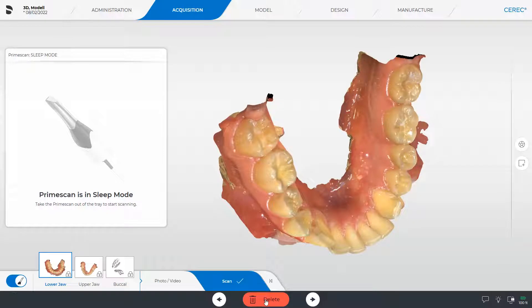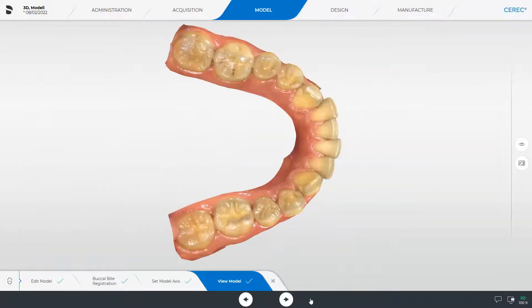We now go to the next phase, the model phase. This phase can be used for patient communication. In this case, we have already removed some areas which are not needed for a solid model in the edit model step, and now switch to the next phase, the design phase.